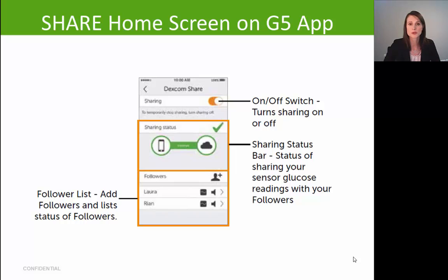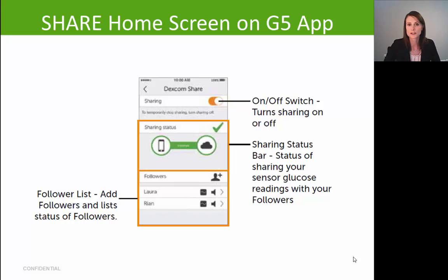This is the home screen of the share feature. At the top you can turn sharing on or off — toggling it off stops sharing with all followers. You also have the option to stop sharing with an individual follower by clicking on their name and toggling that switch off, while all other followers continue to receive your glucose information.